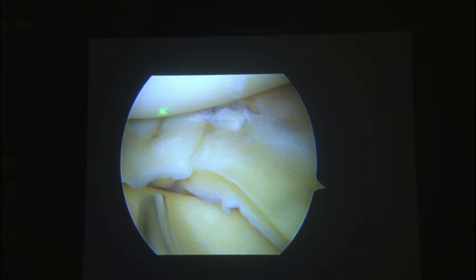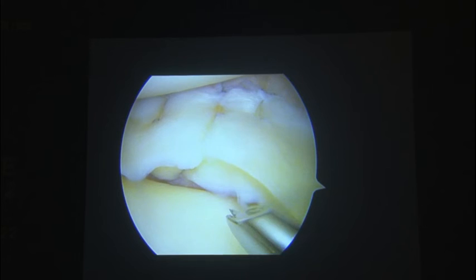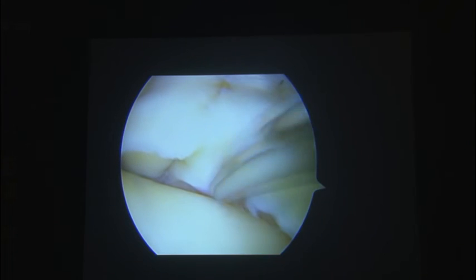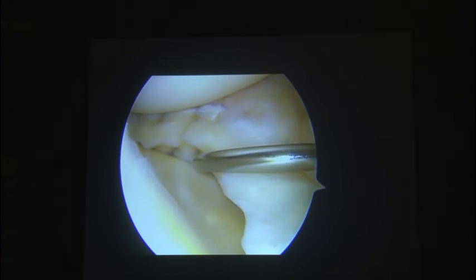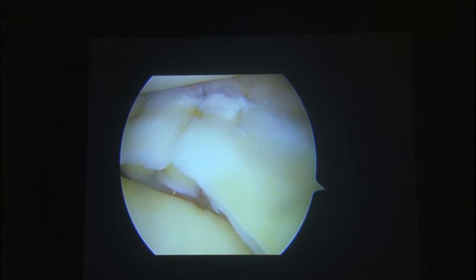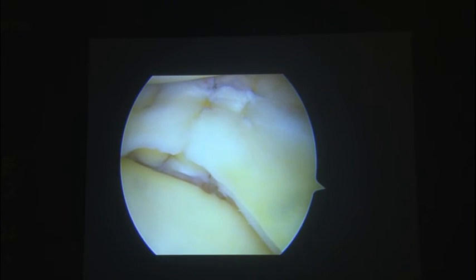This is the repair — this is the right knee and the posterior has been repaired. For the posterior, we were working from the diagonally opposite portal, that is the anterolateral portal. Now for the mid body, you are visualizing from the anterolateral portal and from the medial portal you put the device in. Why is it safe? Because you are away from the neurovascular bundle. Always come from the diagonally opposite portal whether it's the medial or lateral side. The needle preloaded with high-tensile suture is fired, the assistant retrieves it — pass it on the meniscal side first, then the capsular side. As you pull on the sutures, again you restore the meniscus flounce, achieving a good stable repair, then tie it off immediately.